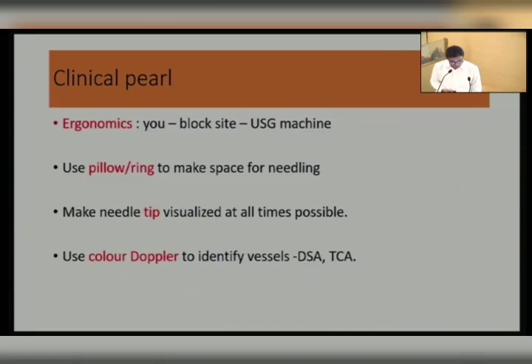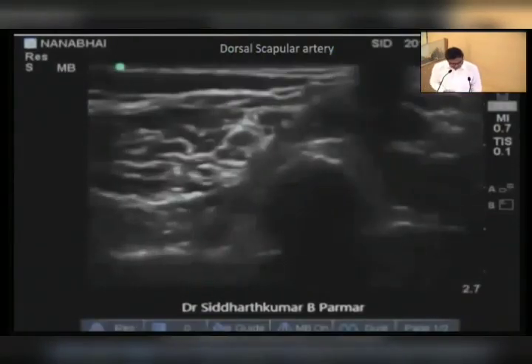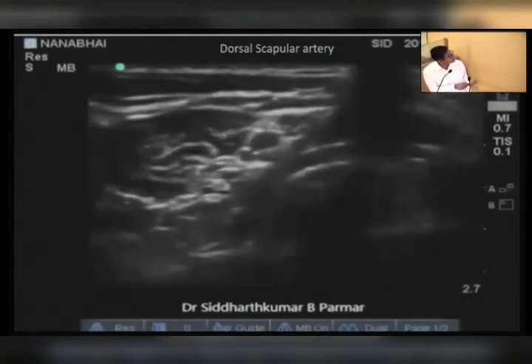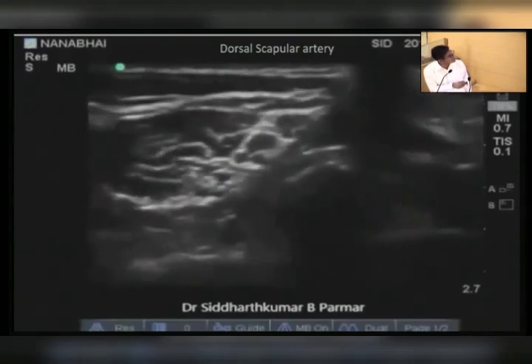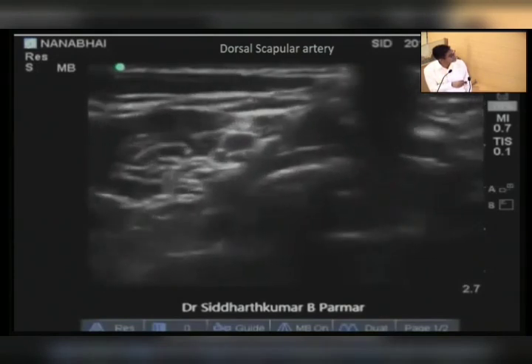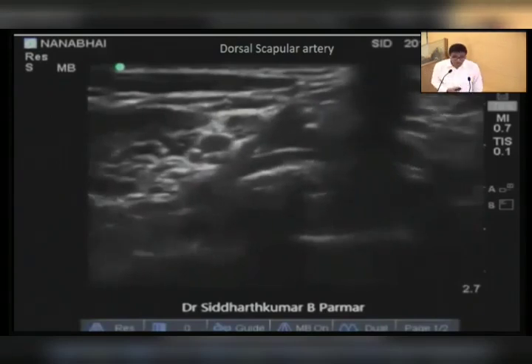See, in one of my videos you will find the dorsal scapular artery is over here. Can you see? This is a big one, which is crossing the plexus over here. This is middle scalene, this is anterior scalene, and this is the plexus. C5, C6 split, and C7. This is the dorsal scapular artery over here. So vessels are normally there, you have to avoid them.